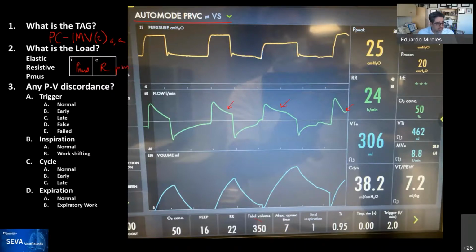Rob, disagreements, agreements, or anybody else disagrees? No, so far so good. Okay. Aha, yes. The auto mode became active on the third one. That's correct, team. And then it went back to mandatory.